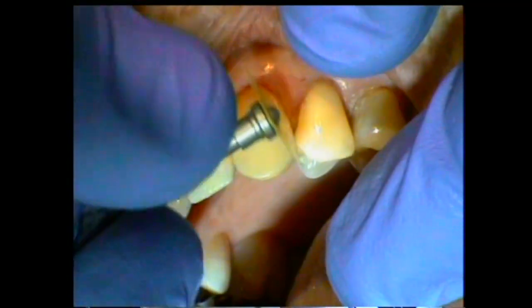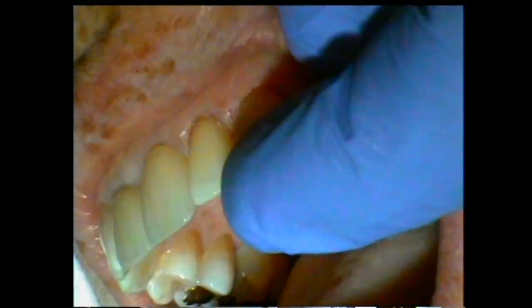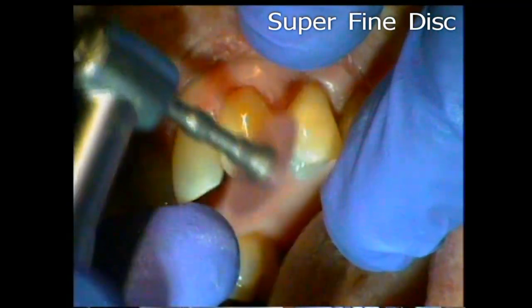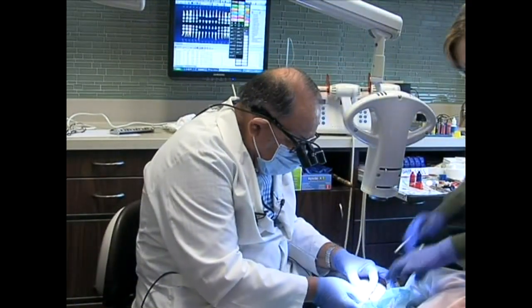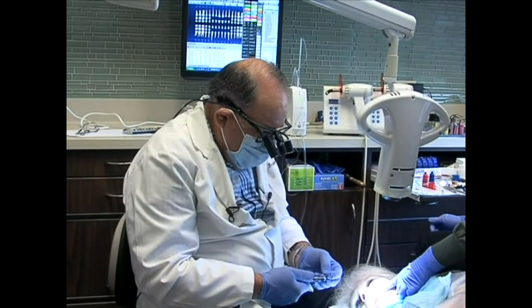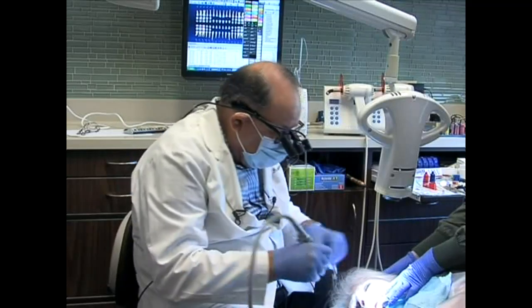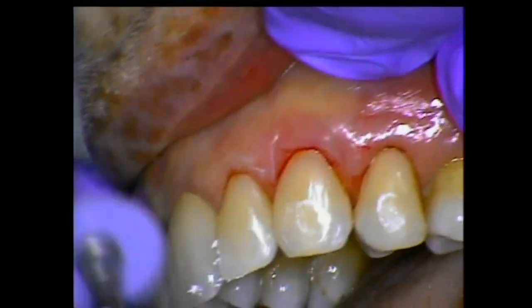We went through medium, now we're going through fine, and I've blended this into the other composite — you can't even see it. It's a little polishing paste on each tooth, and then we have a felt disc. It has a mylar back but it's got a felt — it's like chamoiseing shoes — and we just go ahead and run this on the tooth surface like so.